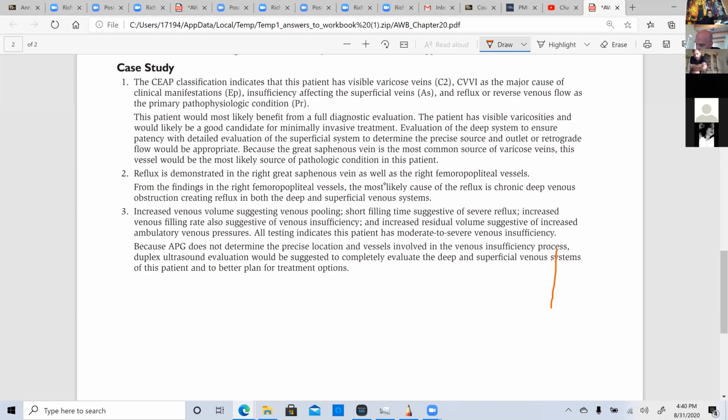Okay, number 2, a 52-year-old female presents to the vascular lab for varicose vein evaluation. Findings during the evaluation were as follows. Right great saphenous vein, visually enlarged and tortuous. Retrograde flow lasting 750 milliseconds. And what do we say? 500 milliseconds is the top end of normal. So that's definitely reflux. Retrograde flow is also visualized with color throughout the entire length.